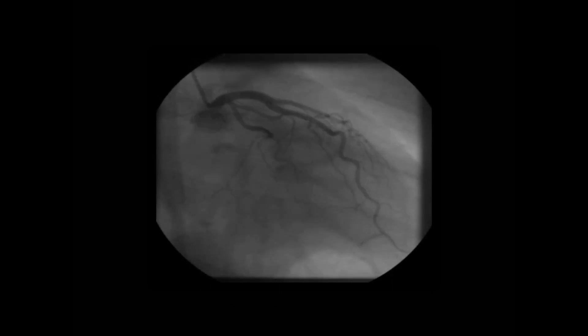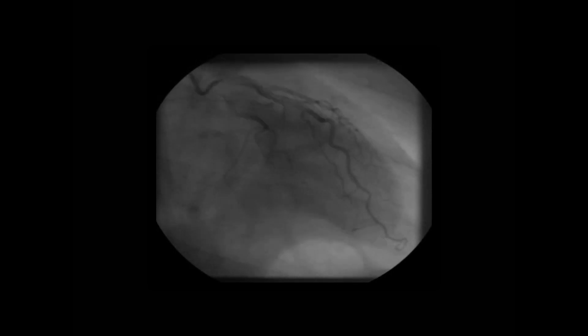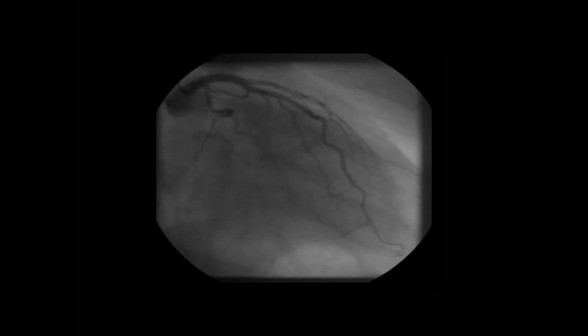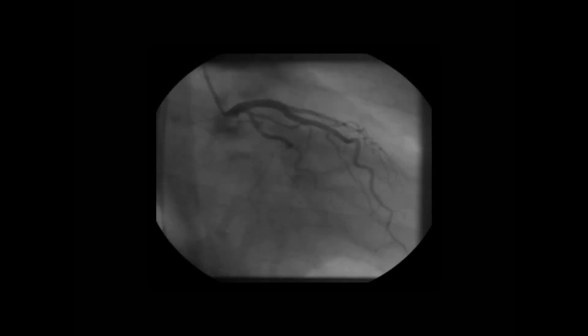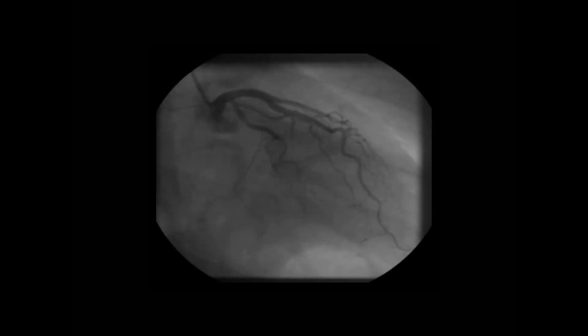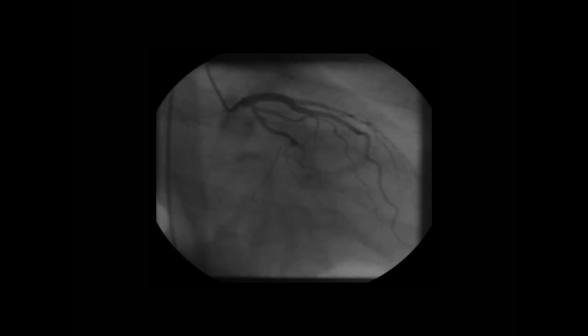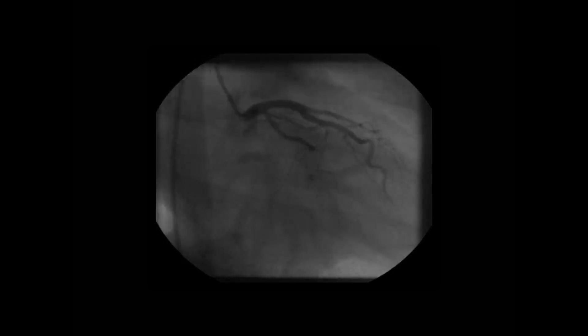CMR can show us the morphology of the left ventricle, the regional wall motion abnormalities, and allow us to quantify left ventricular function. However, we do need an invasive coronary angiogram to assess the coronary artery anatomy. This is the left coronary artery in a patient with Takotsubo cardiomyopathy, and we can see that the coronary arteries are entirely normal. The left anterior descending and circumflex coronary arteries show no evidence of any significant disease.